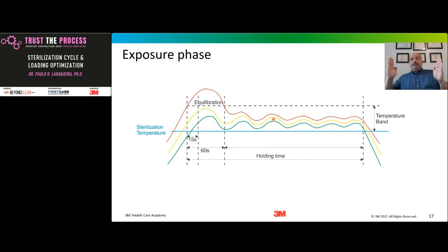We can extend it. The extension of this exposure phase is normally driven by the type of the medical device that requires more time to reach temperature. It's not going to be within the 60-second range. It's going to require more time for the lowest temperature to reach or to be above the sterilization temperature set point. But as a rule of thumb, this is what we use: 4 minutes or 3 minutes. And that's where we have the inactivation of the spores.